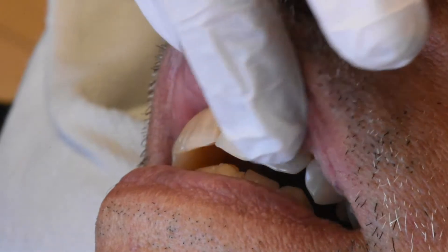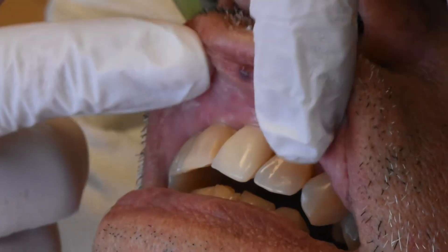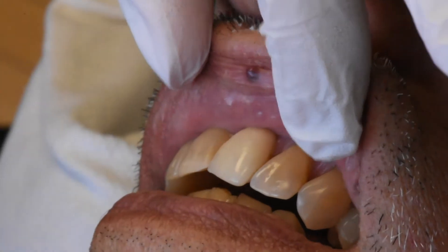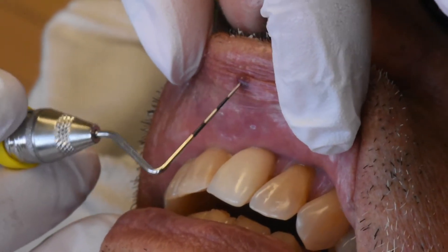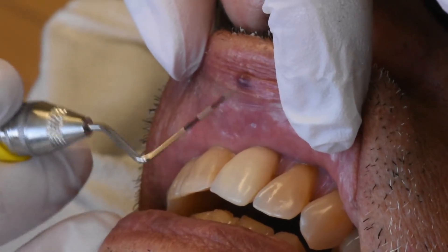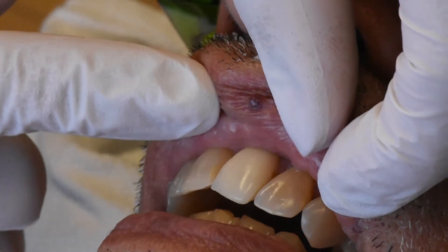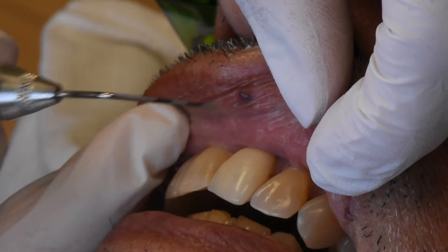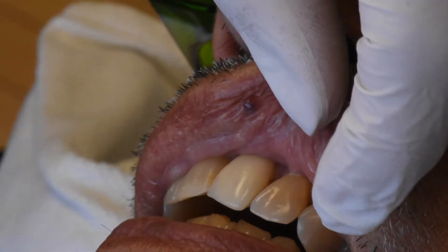Today we are doing a procedure to treat this lip hemangioma. A lip hemangioma usually shows as a result of trauma to the lip, so if the lip was pinched, we can develop a small blood pool right here, almost like a small blood clot underneath the skin. In order to get rid of this, we will be using a laser to coagulate the blood underneath, and then the body will resorb that slowly with time.